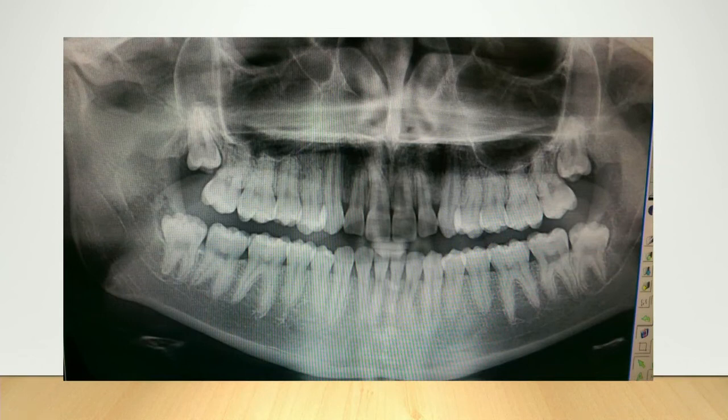So for example, say we're taking out this 3, 4, okay? If you had to raise a flap, so say it was carious right down and there was no tooth structure left, just the root, and then we've got our nerve here, I would raise an envelope flap, and you can't go wrong if you raise an envelope flap.